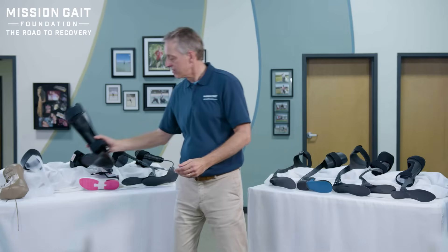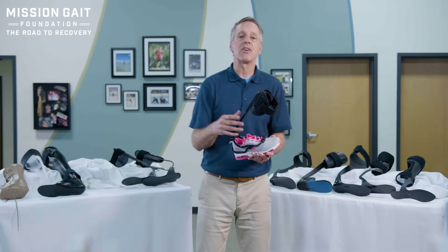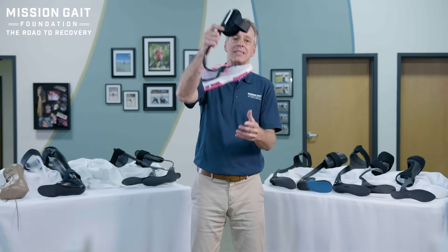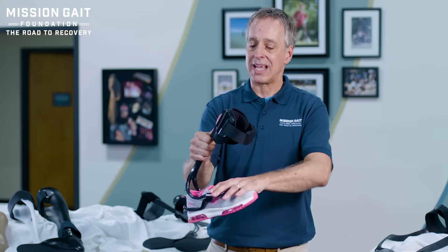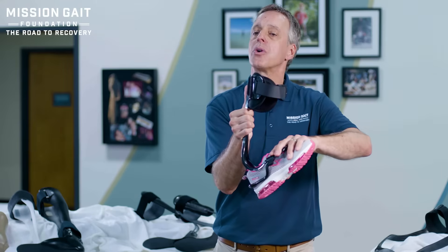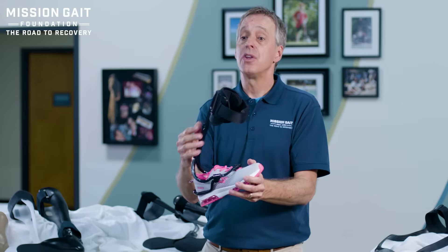In that same family of simply drop foot where everything else works fine, there are other plastic type devices that connect to your shoe. As you take a step, that device will allow the foot to come down and then pick it up as you are stepping forward to clear the ground. This can work really well if you simply need assistance with foot drop and everything else is really working well.